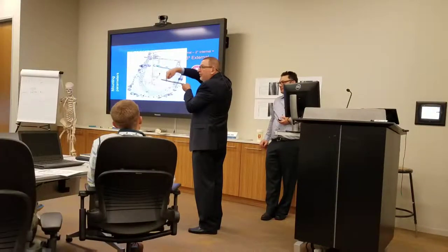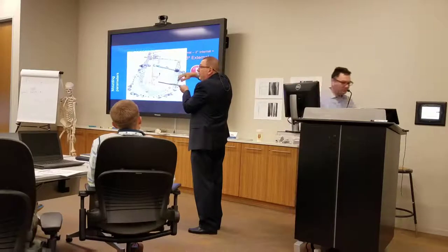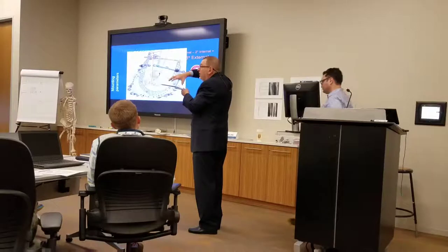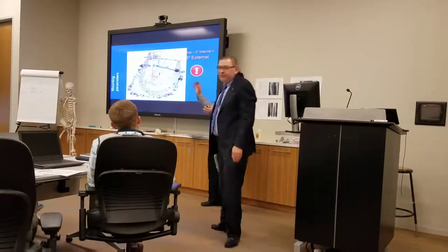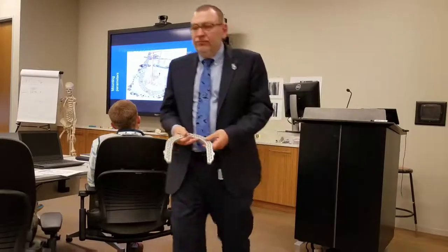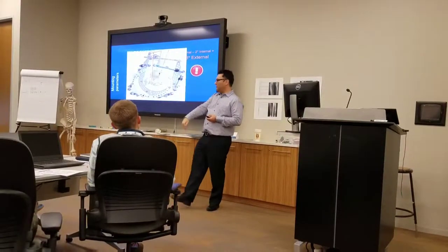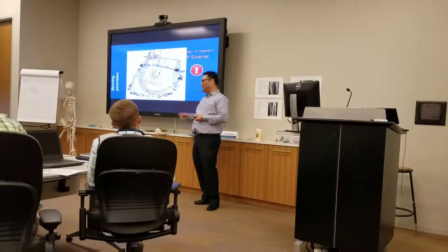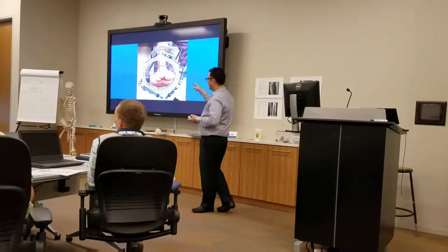And now your patient front is here, but your frame front is here. So you didn't physically rotate the frame, you rotated the strut attachments, which is absolutely the same. Imagine you did a tibia and you just put the struts on the other side. You could put 1 and 2 on the other side instead of facing forward. You just have to tell the program that there's an offset. So that's what this is doing.